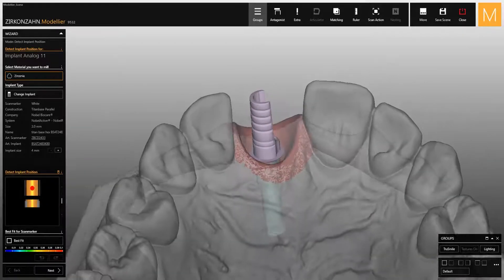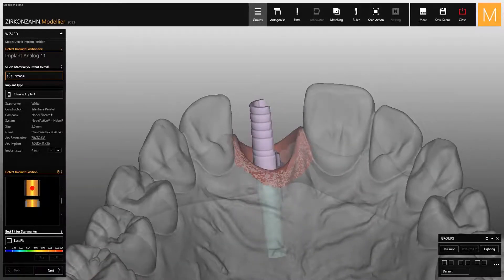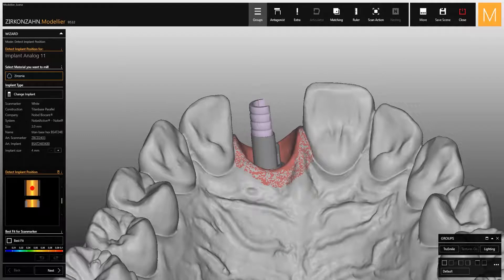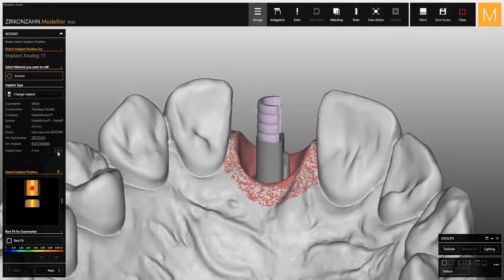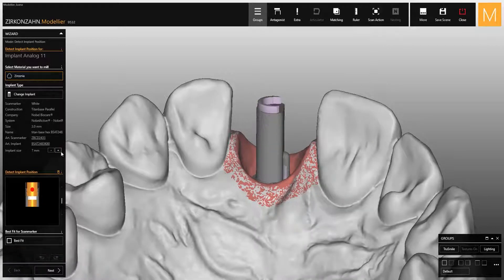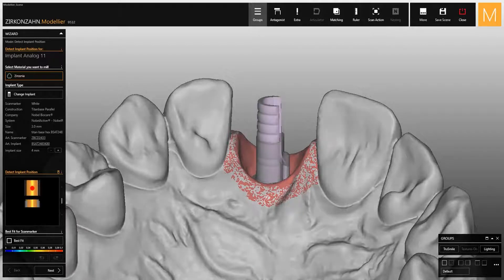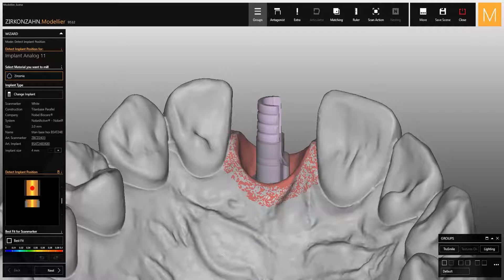The software allows you to view the geometry on which the crown will be based. The height of the base is set at 4 millimeters but can be increased by clicking on the plus button. Each height corresponds to a mark on the real titanium base, which will be cut manually with a cutting disk before cementation.